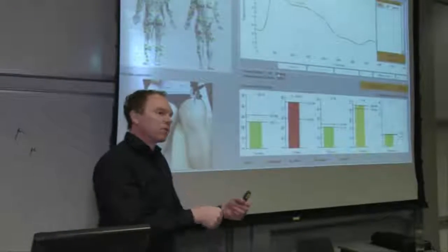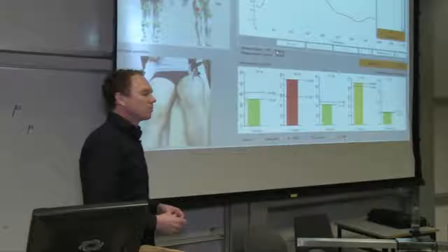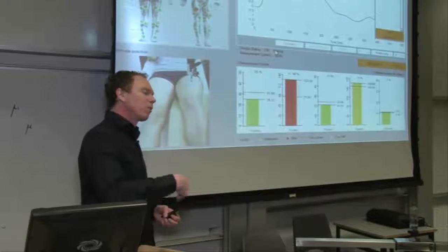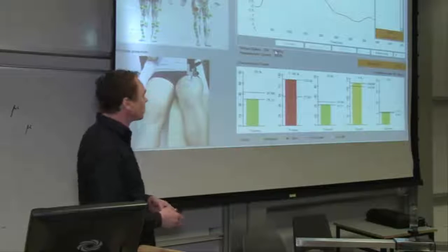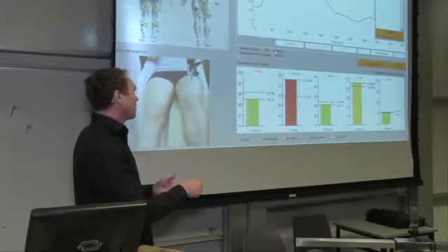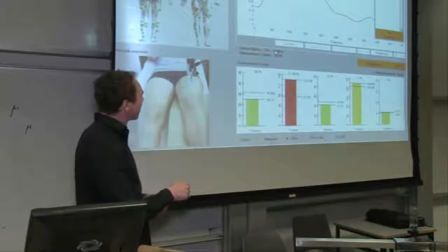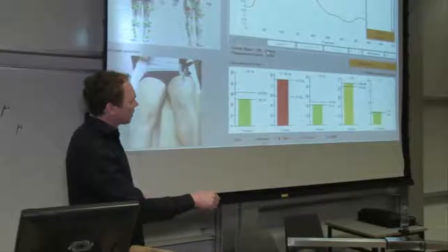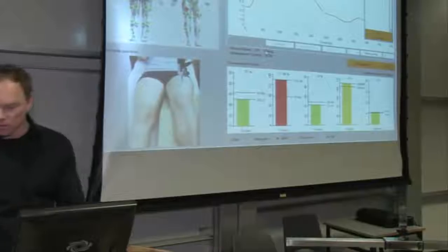So you don't have to force the subject into being completely still, because, like I said, if you do that, you will even affect the results a little bit because you will prevent the movement. So again, 20% faster. So you're right on the mark. 20% faster than the average, and the tonus is, again, almost optimal. So good result here.